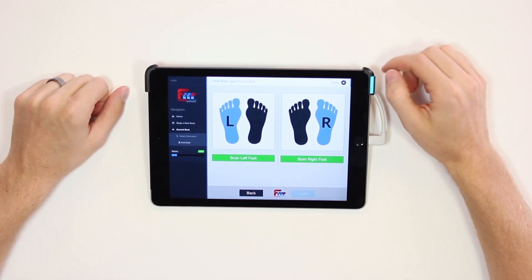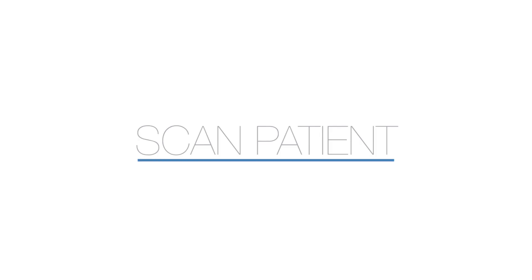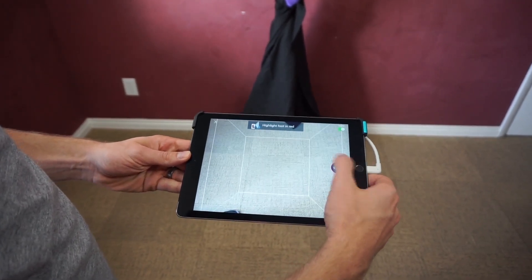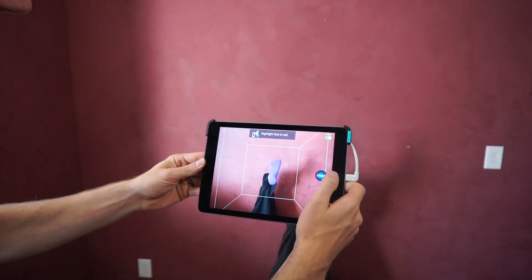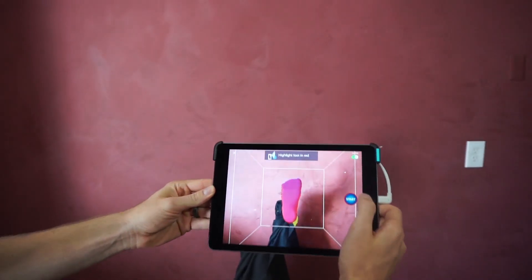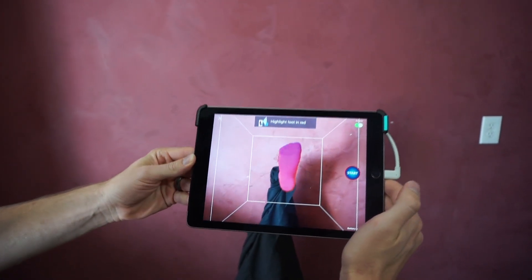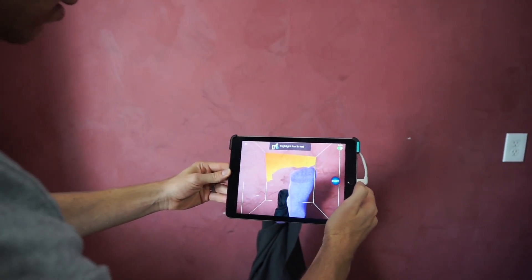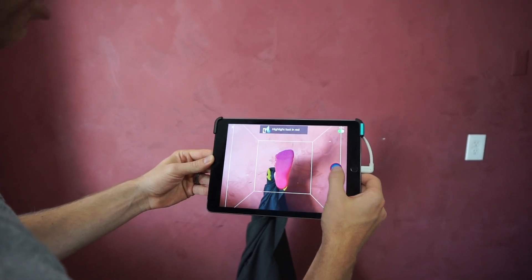That takes us to the scan page, so let's scan a foot. Now that we've begun scanning, you can see a white box appears. We're going to position the foot in the center of the white box and move about two and a half feet away until the foot is highlighted in red. If we're too far away, the highlight will be yellow. If we're too close, the highlight will disappear. Once we have that nice glowing red, we'll hit start.